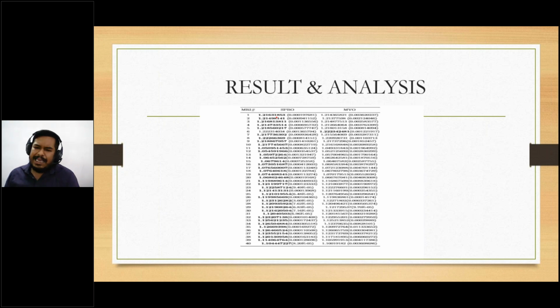So if we are taking 10 independent runs for each pair of images, then I have 10 different values for mutual information. For these 10 different values for the mutual information, I have computed the mean as well as the standard deviation for every pair of the images that I have registered.